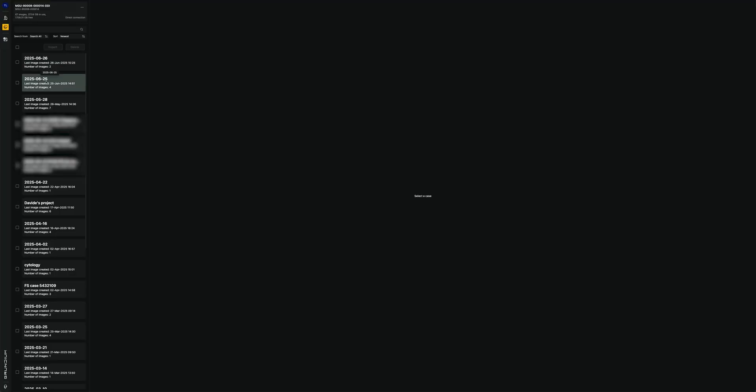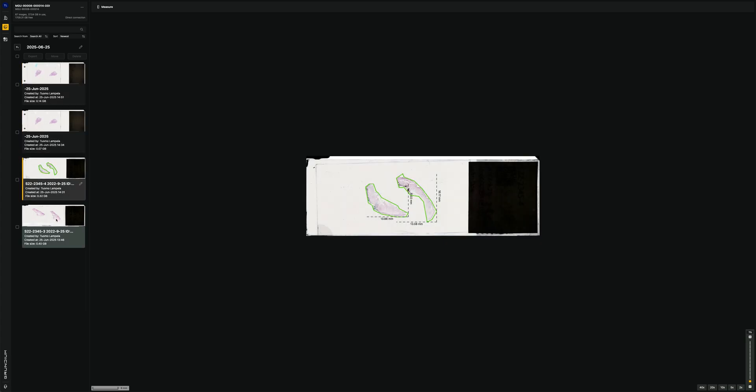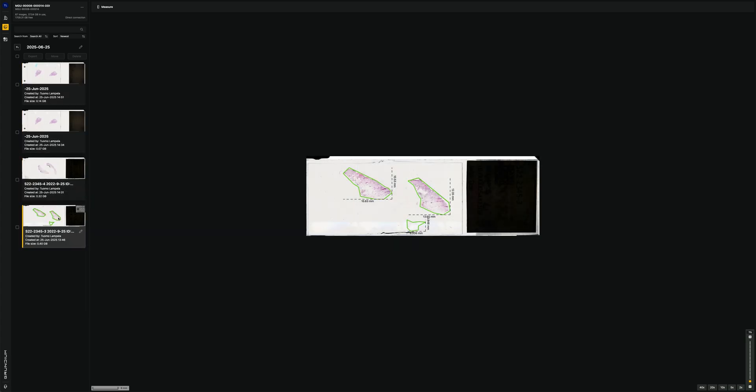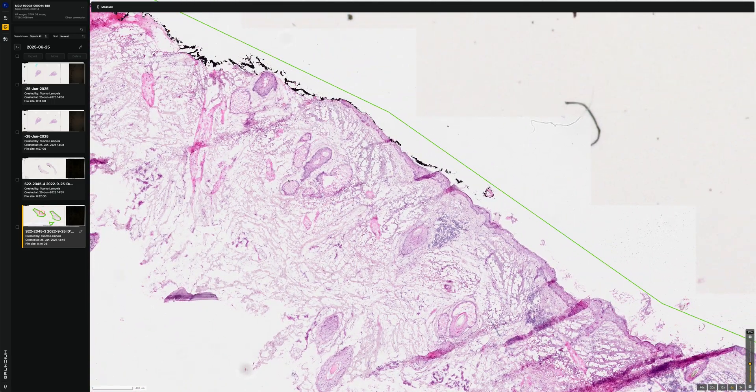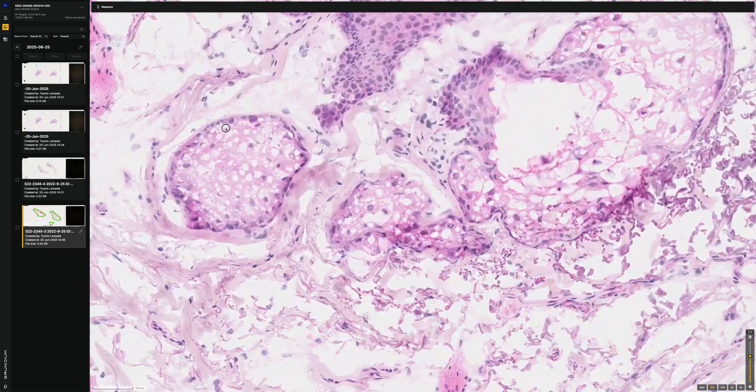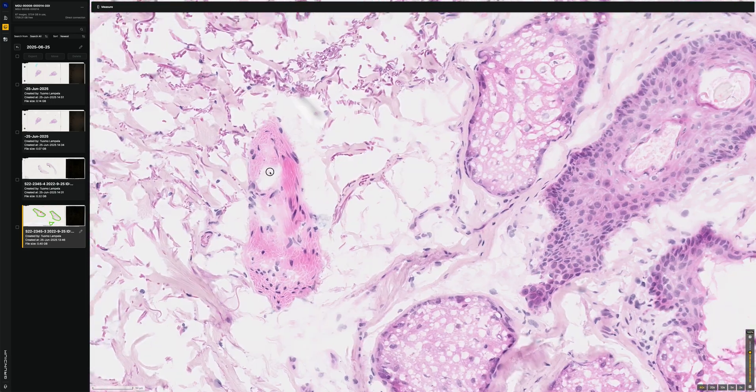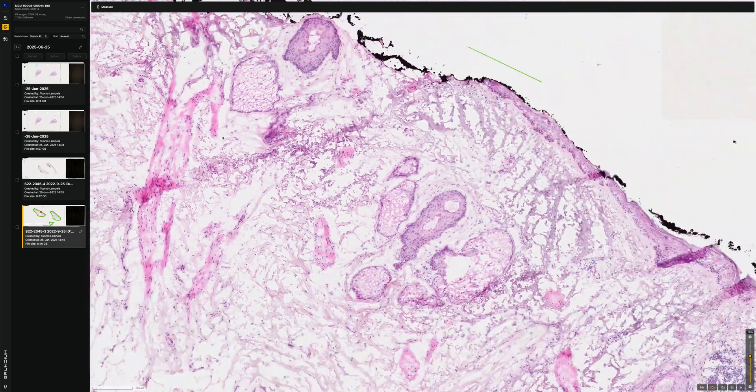So for example, let's look at some images from yesterday. Yesterday, these images have been scanned. And I can just use it like in the microscope, you can just zoom in and see what the images look like.